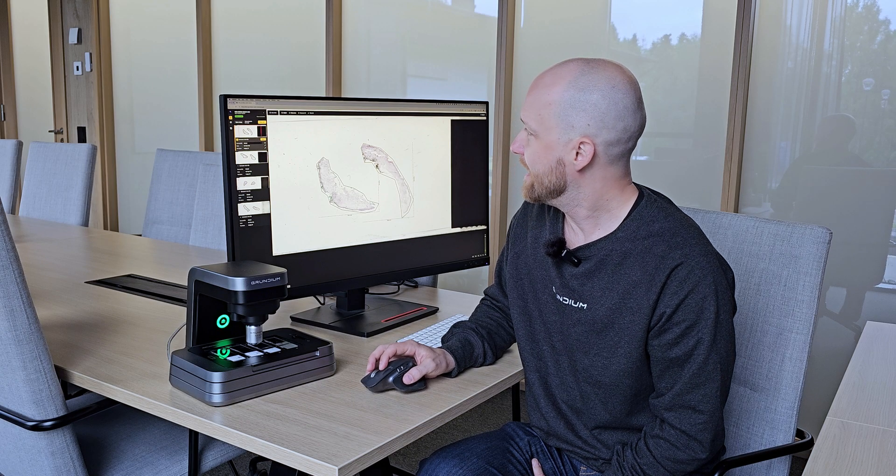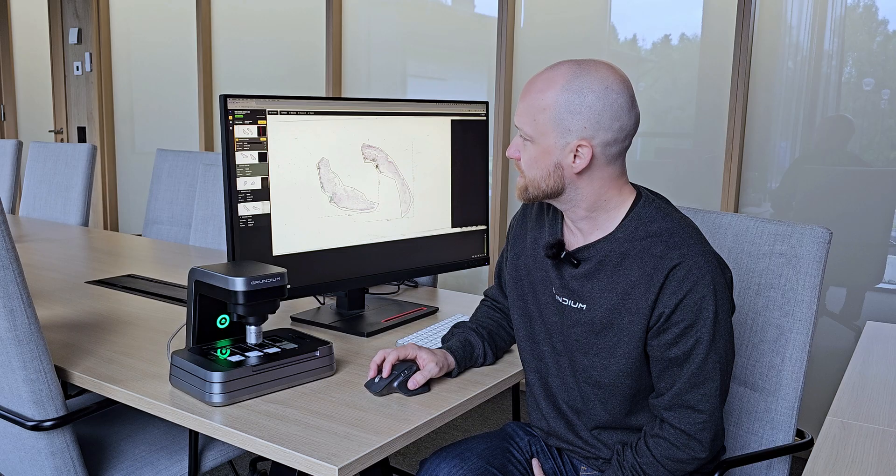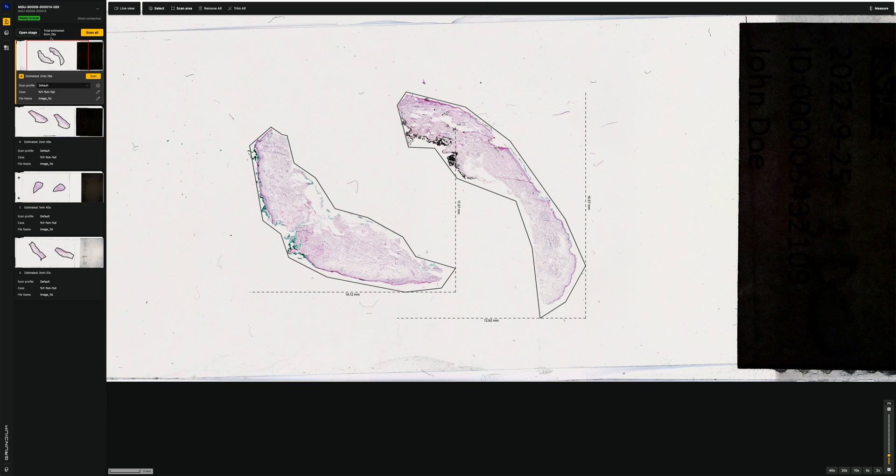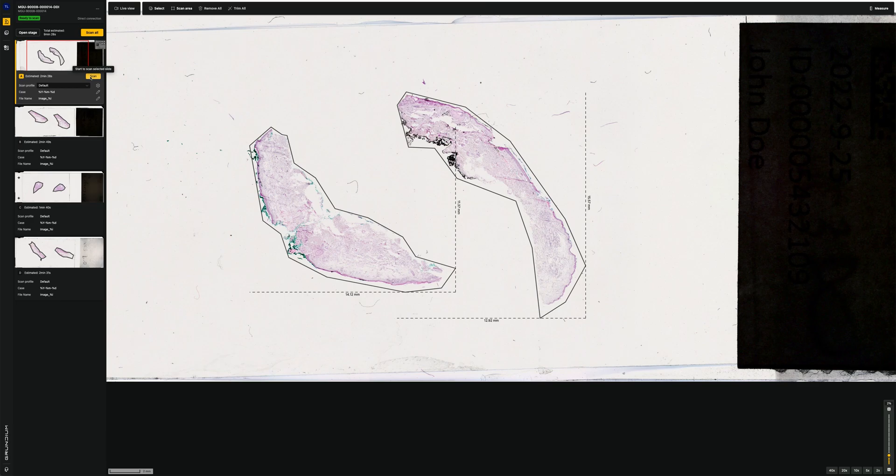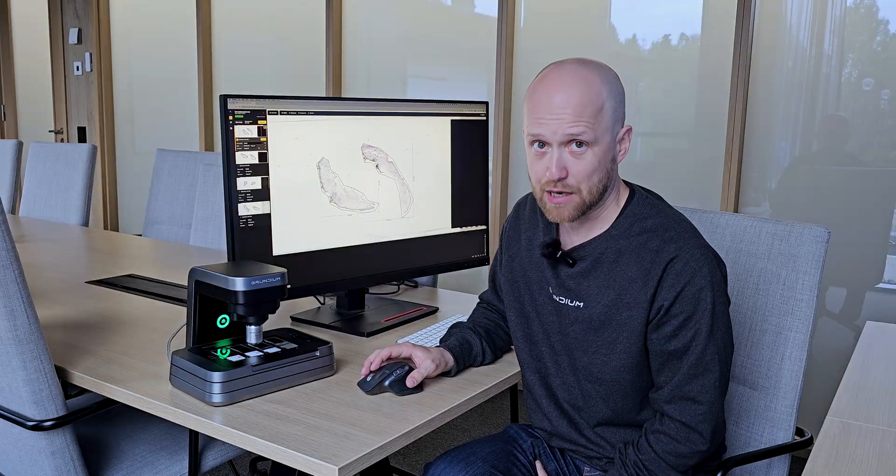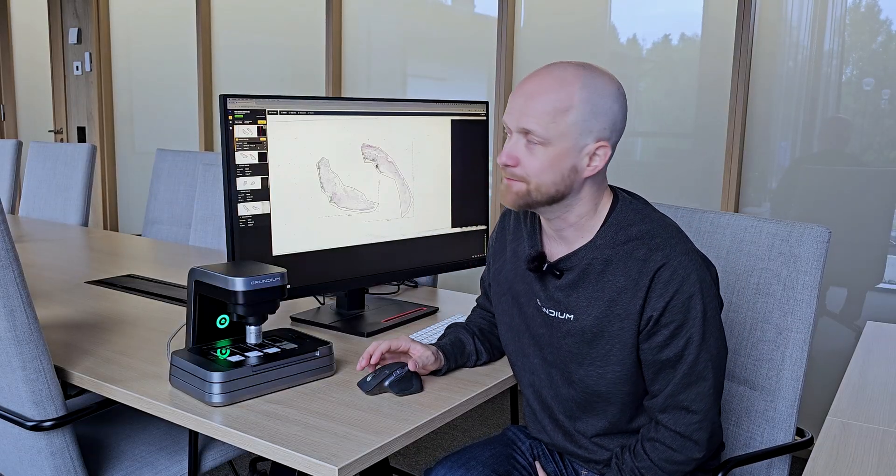And then we can just proceed with scanning. As you can see here, the scanner estimates the total time for scanning all of the slides. In this case would be nine and a half minutes. We can also start scanning each individual slide separately. So we can click scan on any of the slides, and the order that we clicked scan in will be the order that the scanner will scan the slides in.